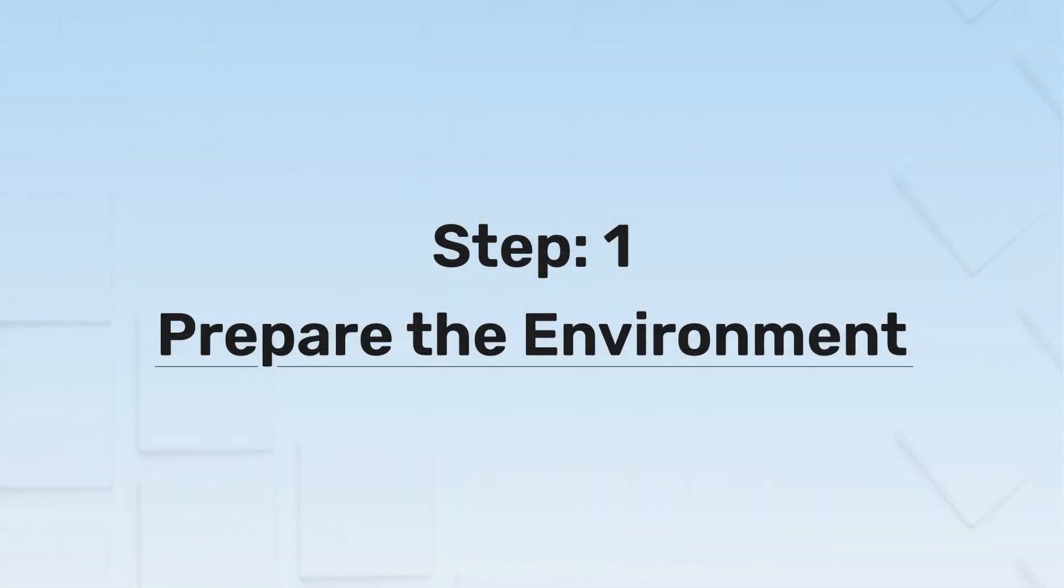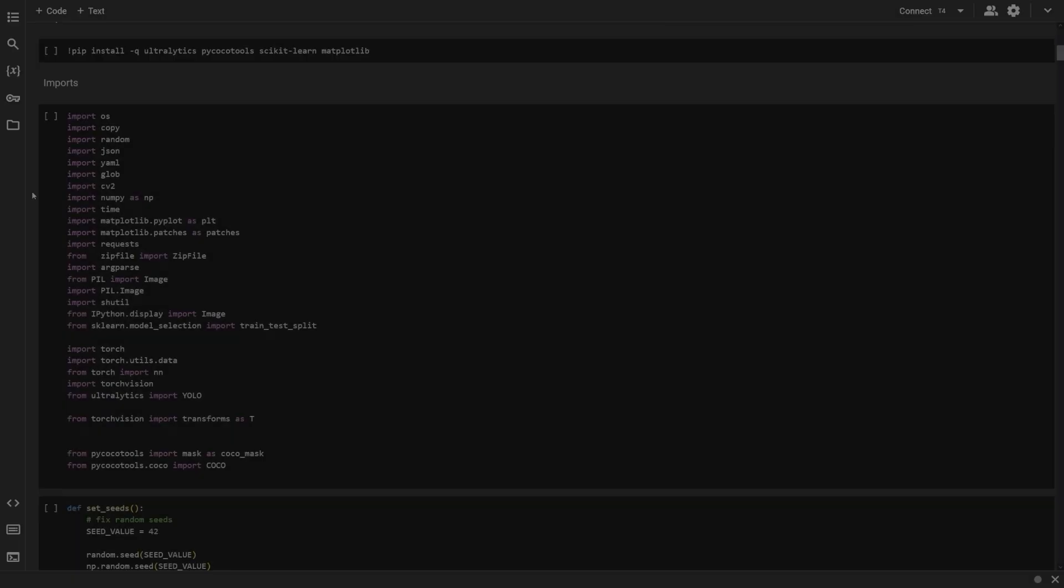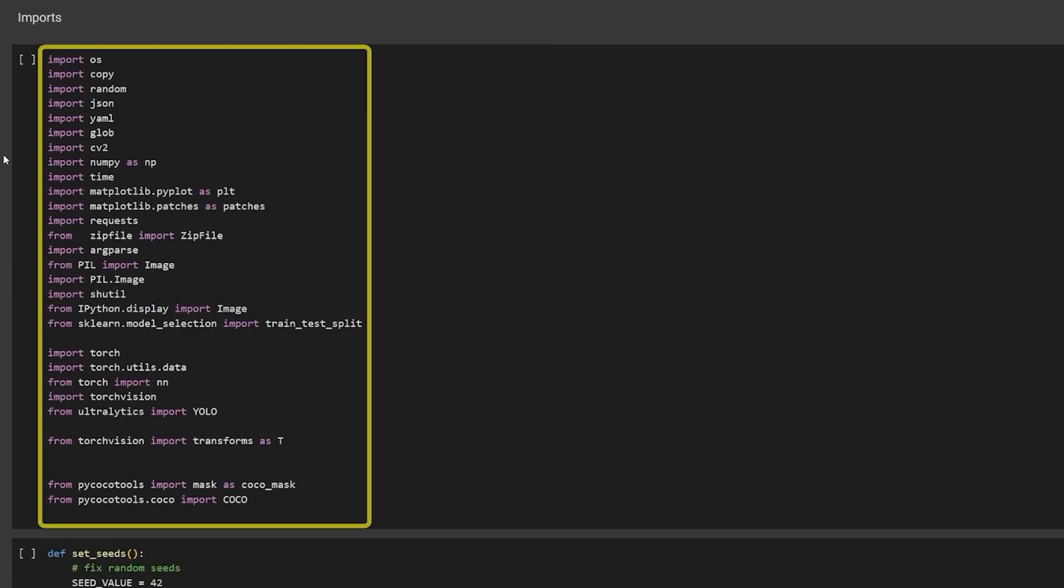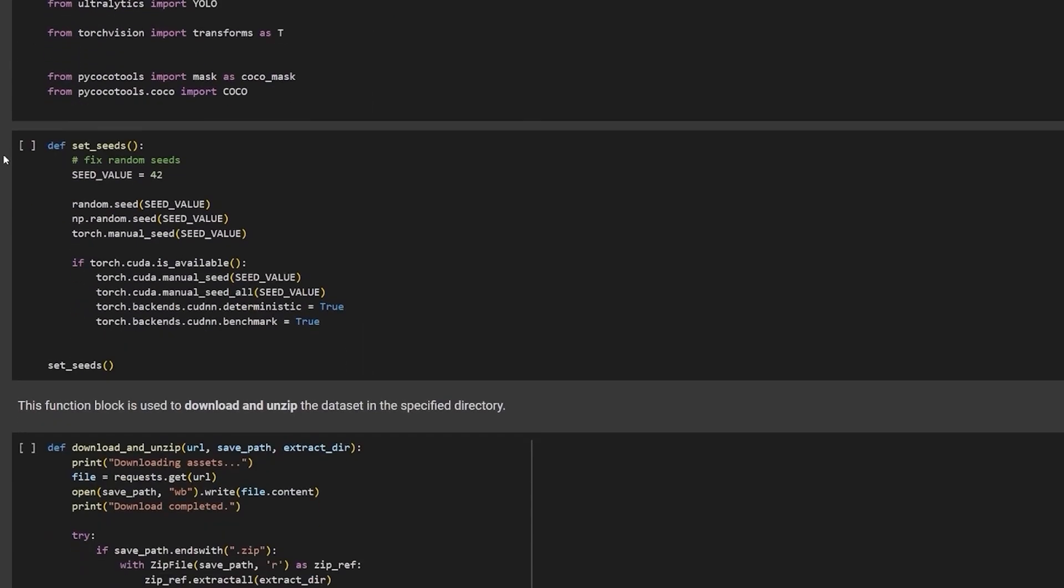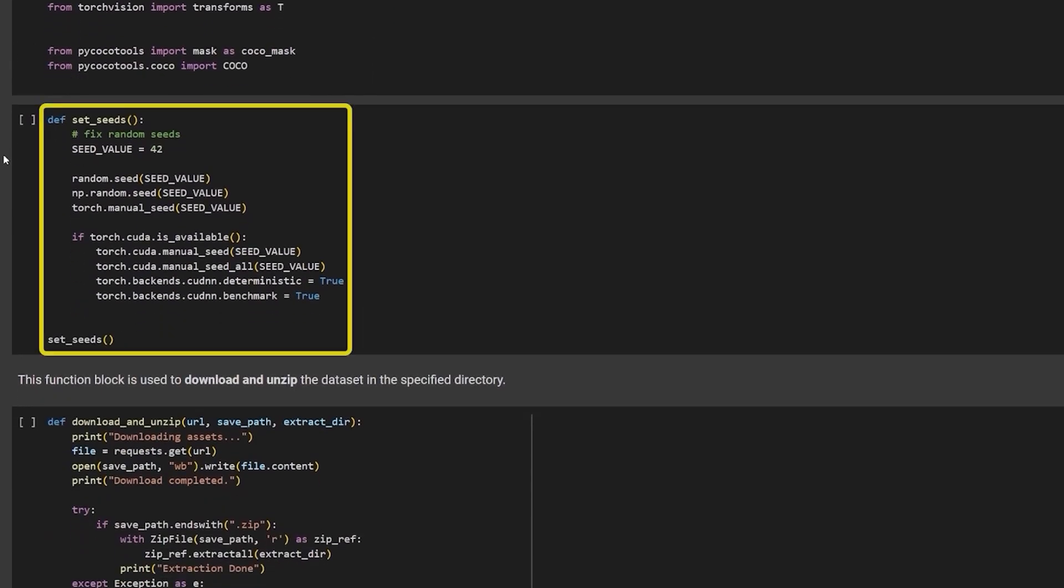Step 1. Prepare the environment. We start by installing the required libraries and importing them. Then we will set the seeds to reproduce the experiments.